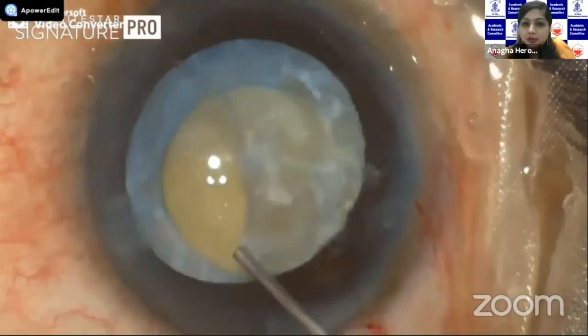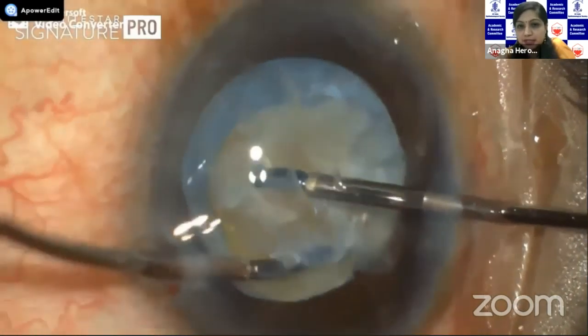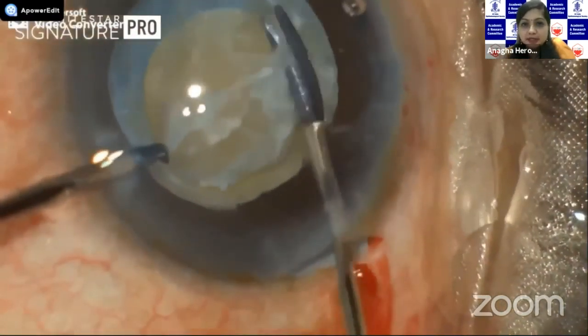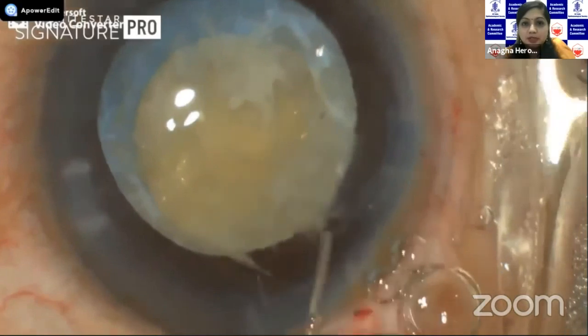This had to be removed properly with a sharp dissection. So we used a 23-gauge micro scissors and micro forceps, and then actually cut off this plaque from all the sides, taking care not to damage the anterior capsular rim. So it was almost like a second capsulotomy.